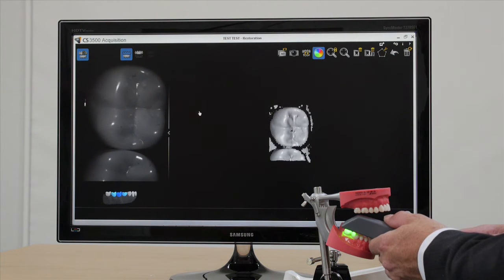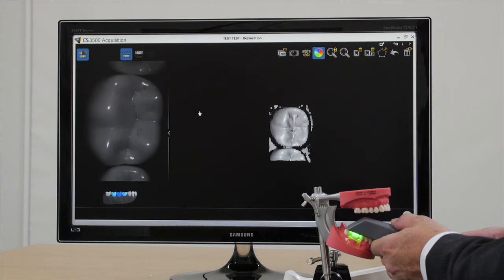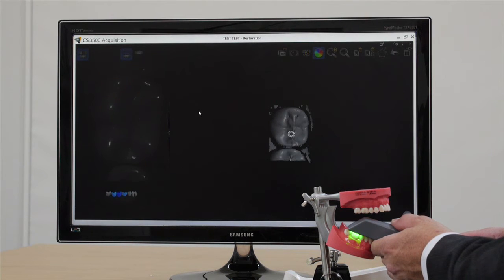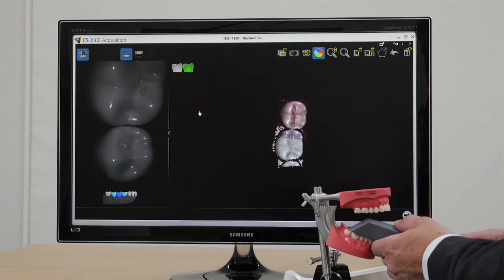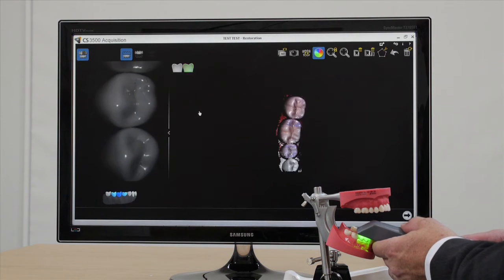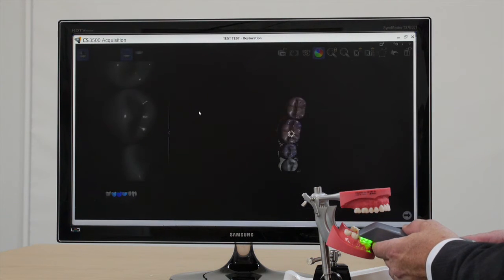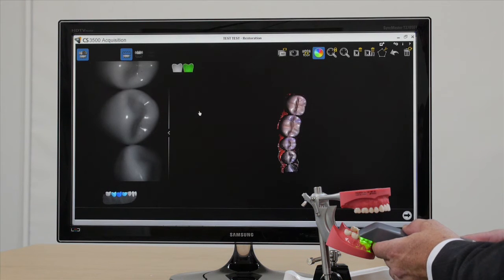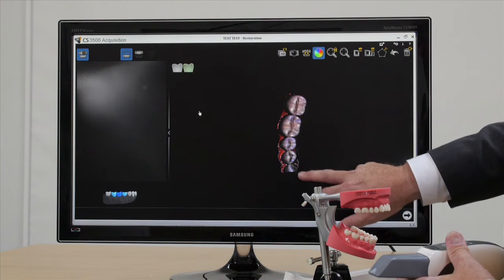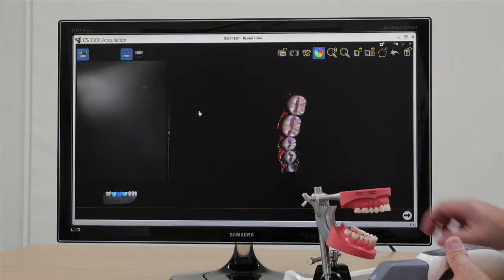Now I'm going to slowly move along the arch and stop. Move along the arch and stop. You can hear the system clicking, beeping every time it's taking the picture. Now, as you can see, I've scanned the occlusal surface.